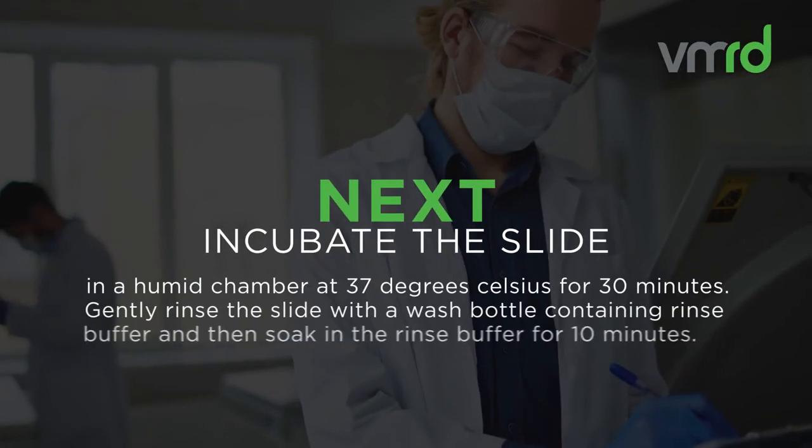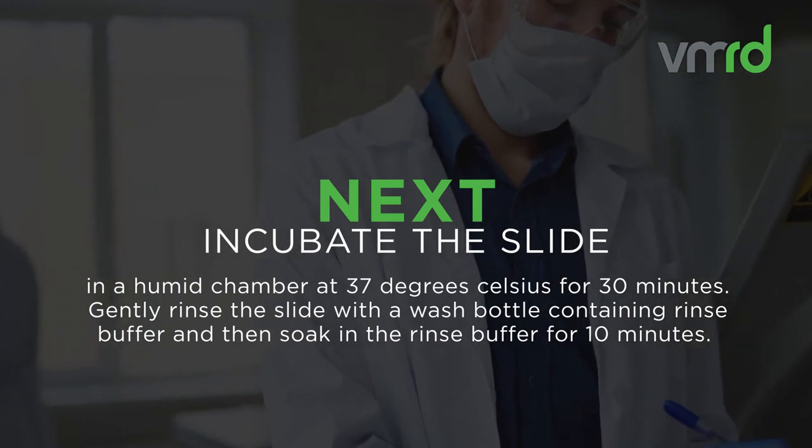Next, incubate the slide in a humid chamber at 37 degrees Celsius for 30 minutes.